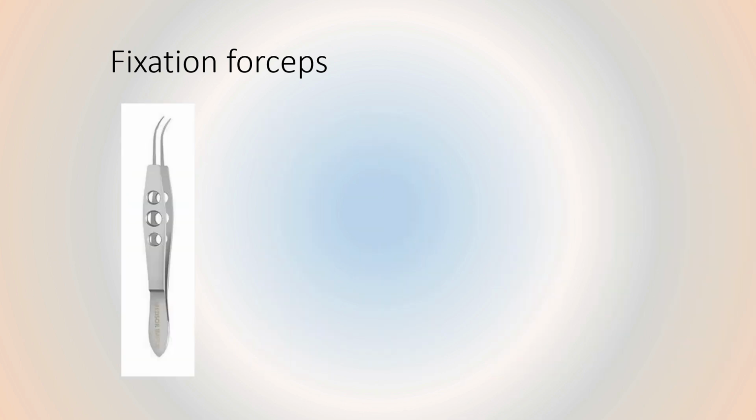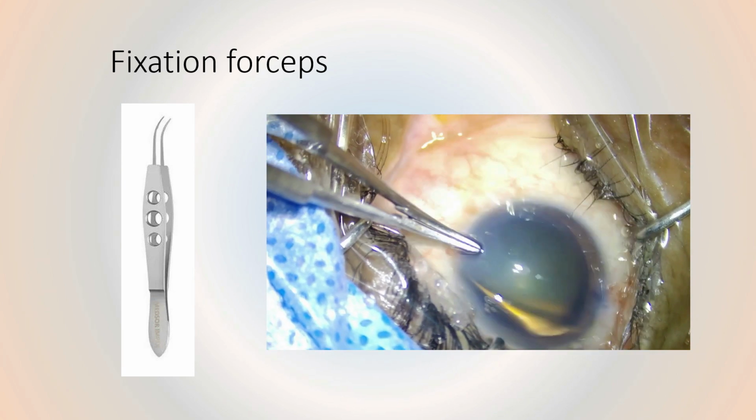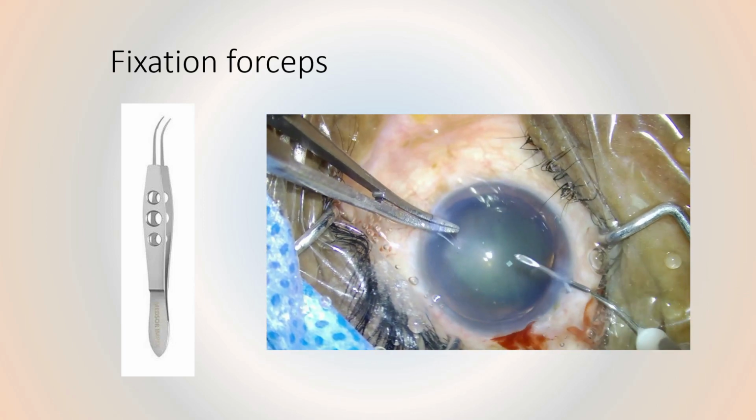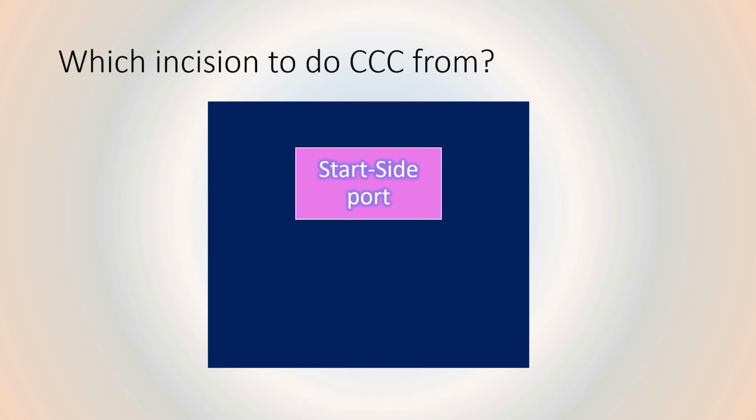The humble fixation forceps is of extreme use, especially in situations where the patient is uncooperative. We fix the eye using the fixation forceps in the left side port, and with the right side port we continue the rhexis.